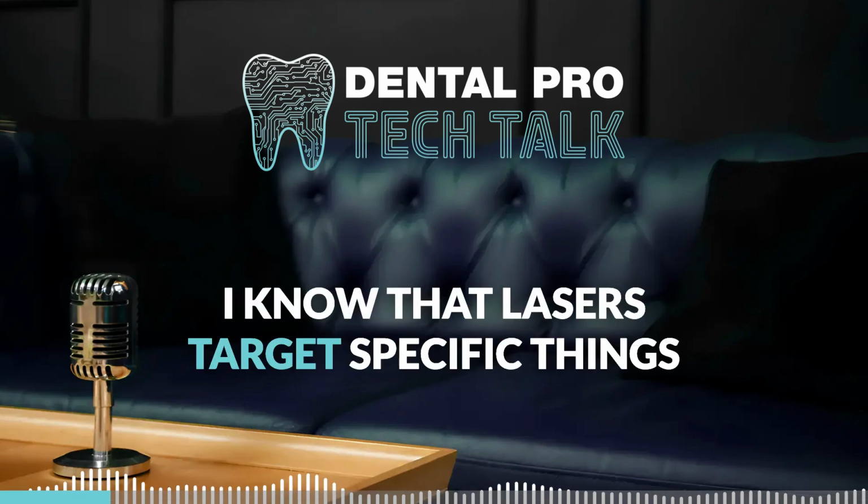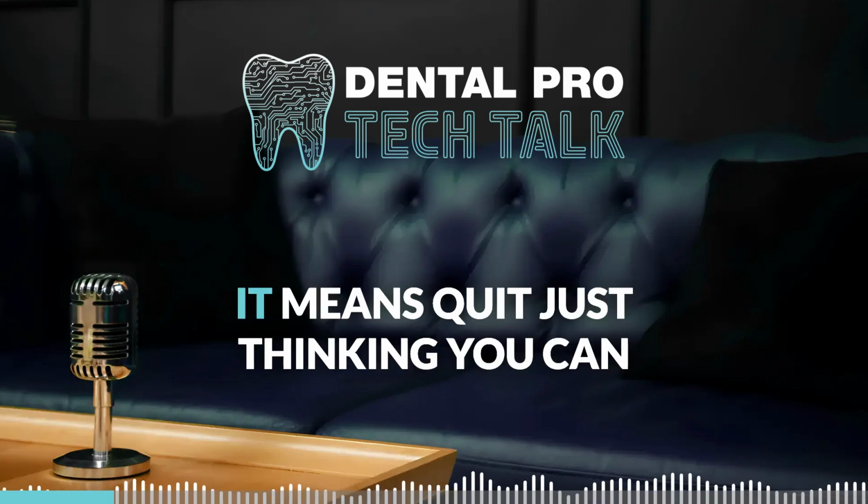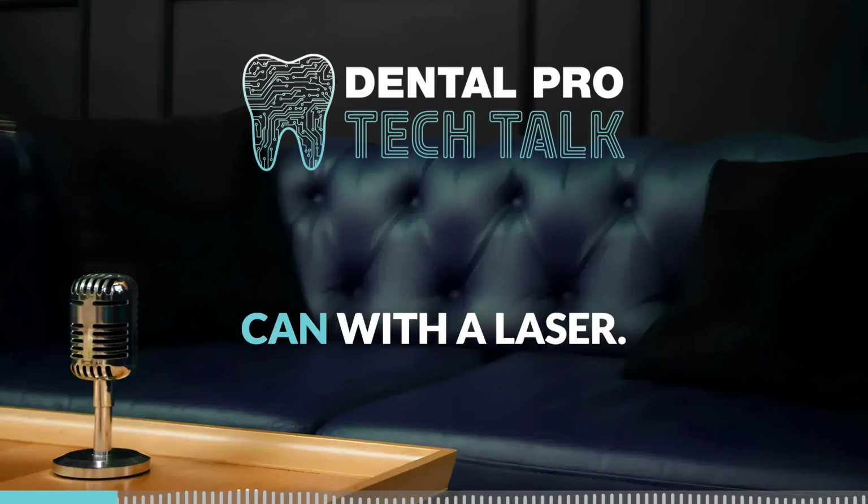Read the tissue. Okay, now that sounds intriguing. I know that lasers target specific things within the tissue. Can you break that down for us a little bit? It means quit just thinking you can use one setting to do everything you can with a laser.